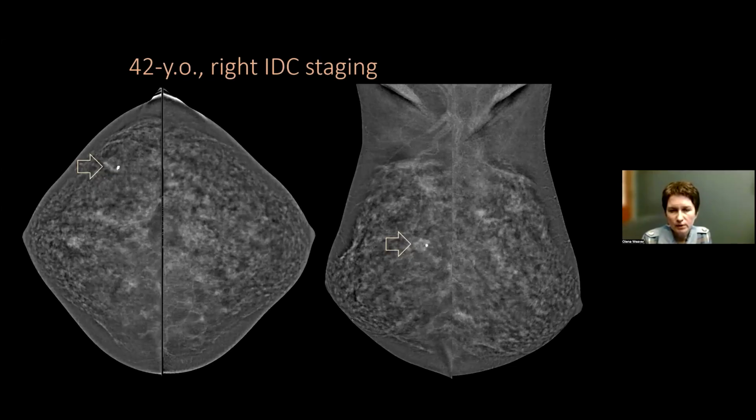And the point of this case is basically that this is a limitation that we have to deal with. Especially at the beginning, when you are just establishing your program, that can make you quite nervous, all the findings that you can find or that you can imagine on a case with marked to moderate background enhancement. Like in this case, is this something?